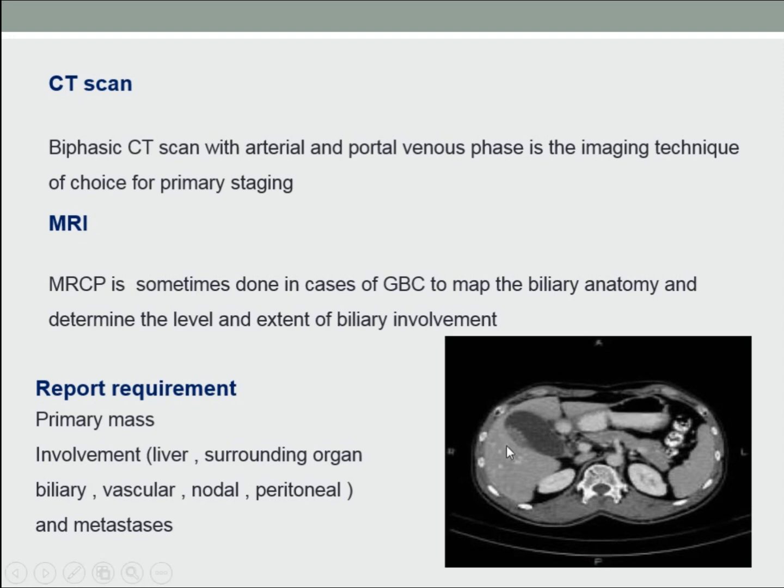While the normal liver, for example, will increase enhancement in the venous phase. So when there is a metastasis, the metastasis will show better as dense on the arterial phase and will appear as hypodense on the venous phase. Not all the tumors, most of the tumors. For example, pancreatic adenocarcinoma is the opposite. It does not show enhancement on the arterial phase. I don't know why, it's just like that. So one reason is to evaluate the arterial and venous enhancement, and second, to see the enhancement characteristics of the lesion. Okay?